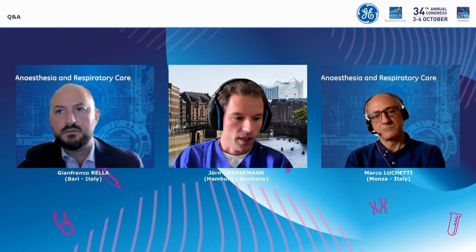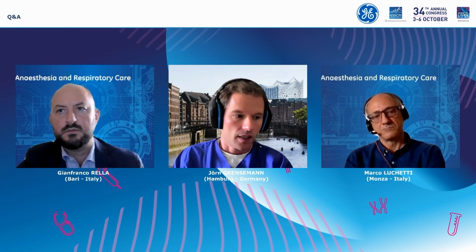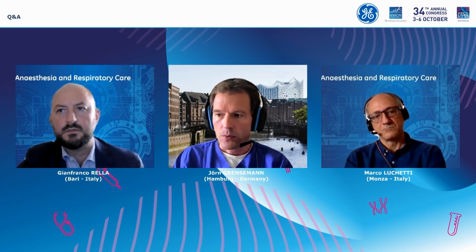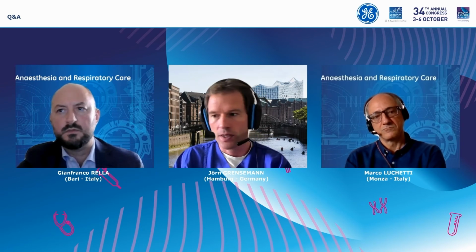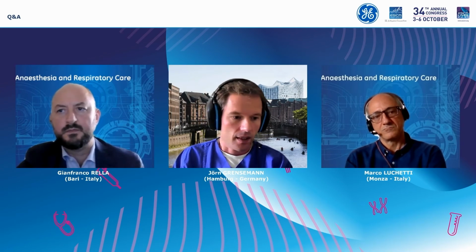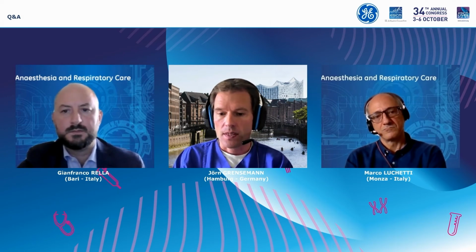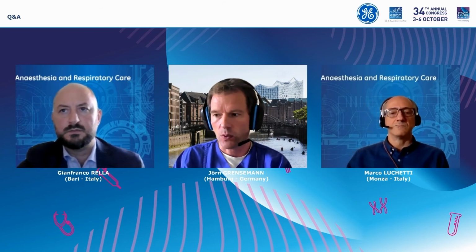So if we need the module somewhere else, then we would again take measurements on the 2nd or 3rd day and on the 4th or 5th day. And afterwards, we would expect, if we could stabilize the patient, that the energy requirements do not change that much. So we would take another set of measurements maybe after a week, 1.5 weeks.